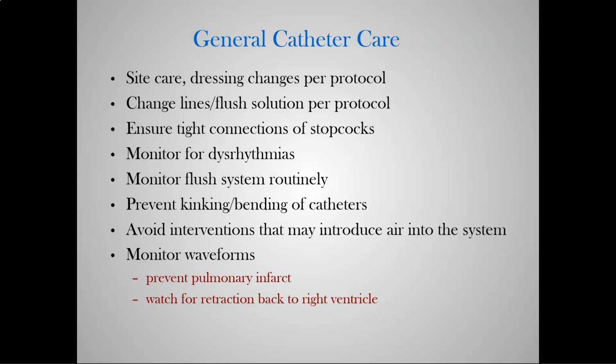Each hospital is different. But again, this is more of a learn on the job kind of thing. Ensure tight connections, absolutely. Do not leave them open unnecessarily. Do not inject any fluids. Don't use dirty syringes. Don't use any of that. Always use sterile contents.